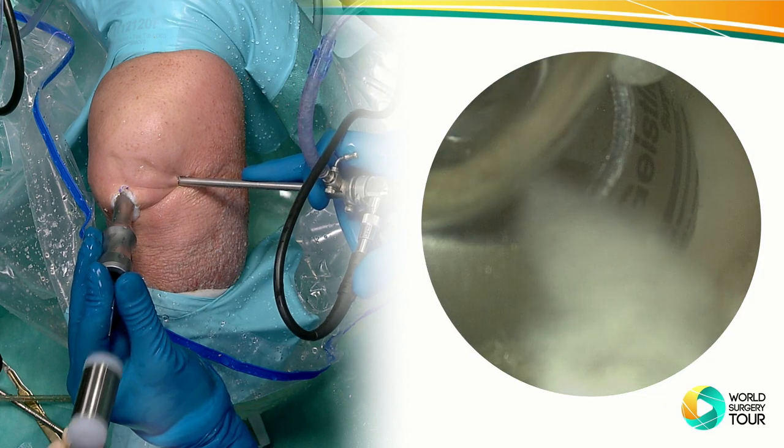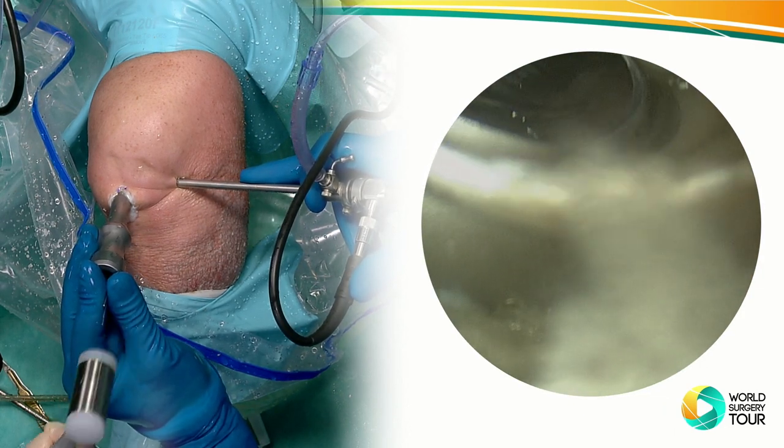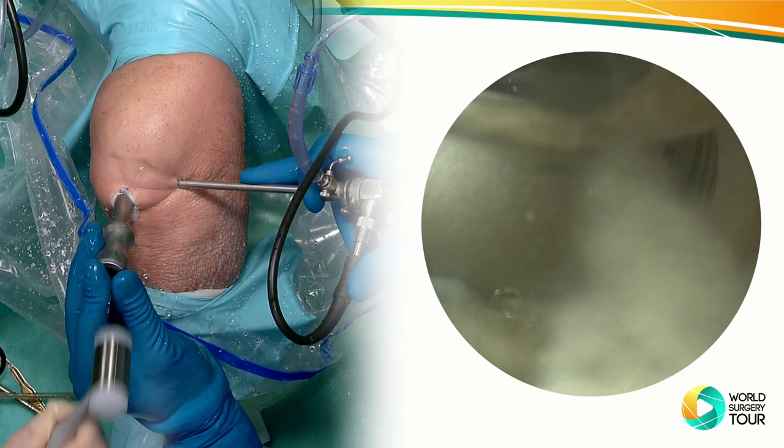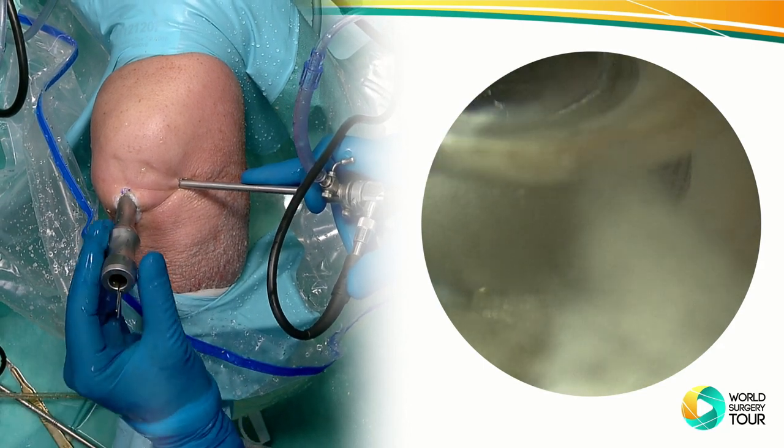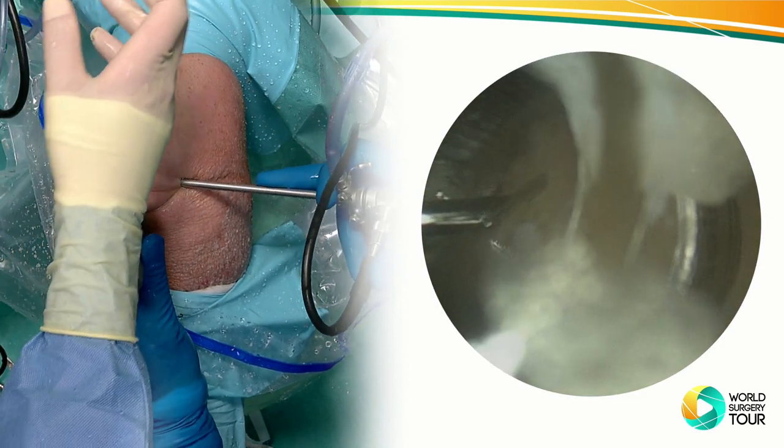Perfect. Same height. And okay. We can remove the central wire. Then K wire remover.